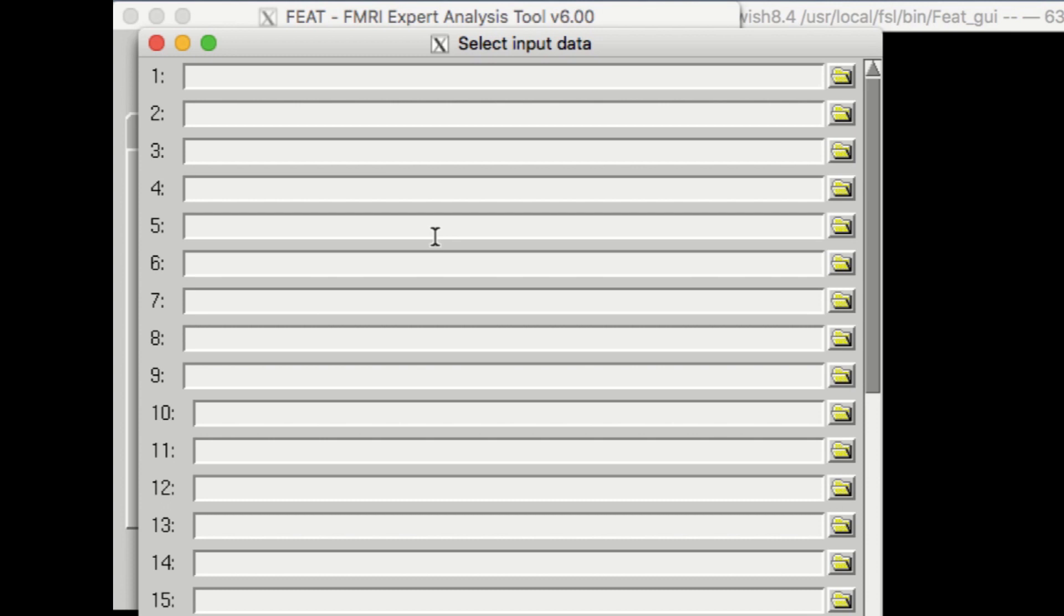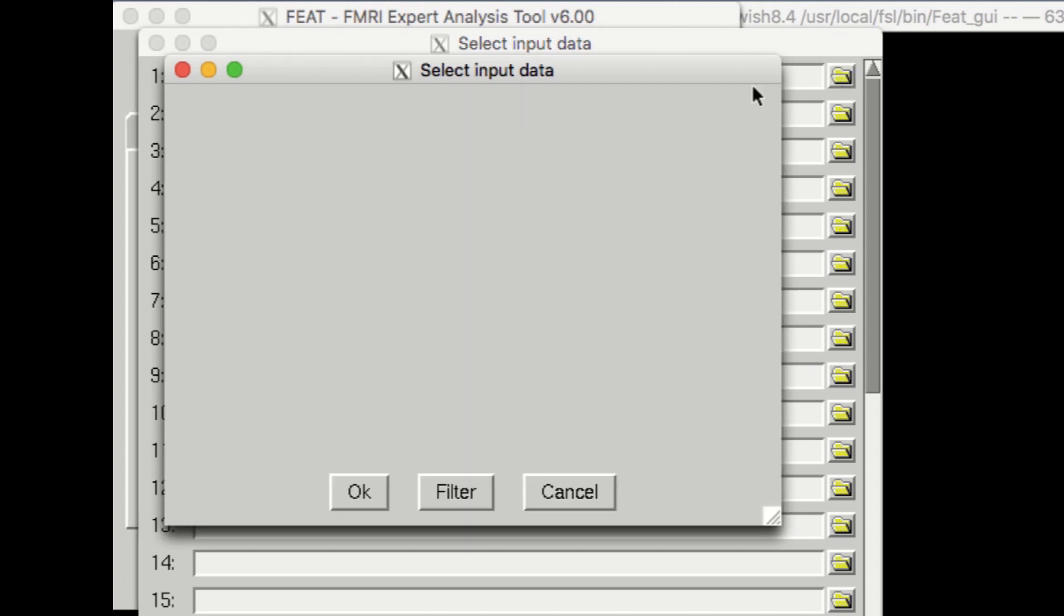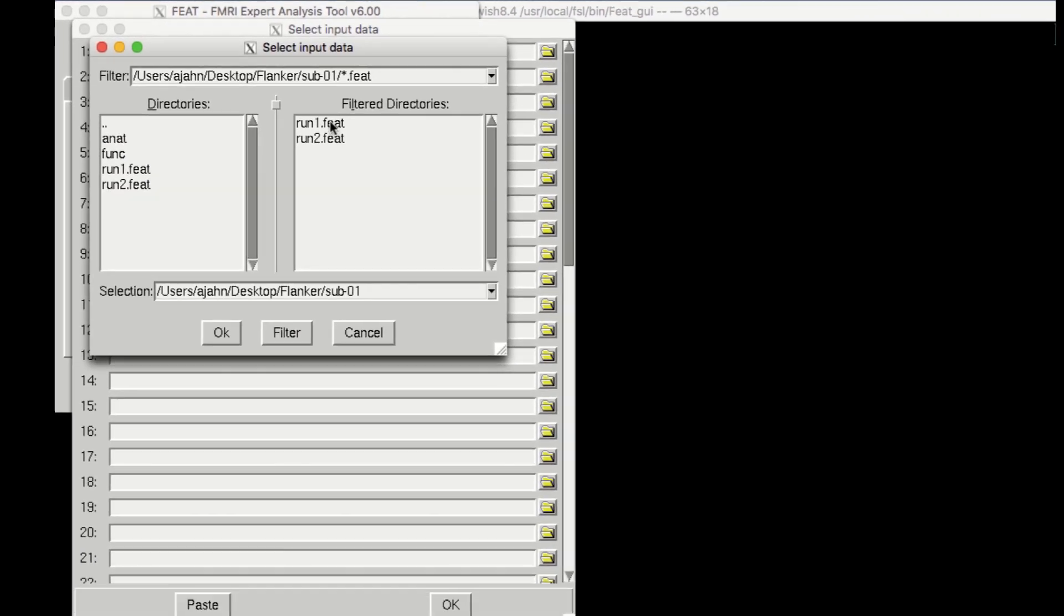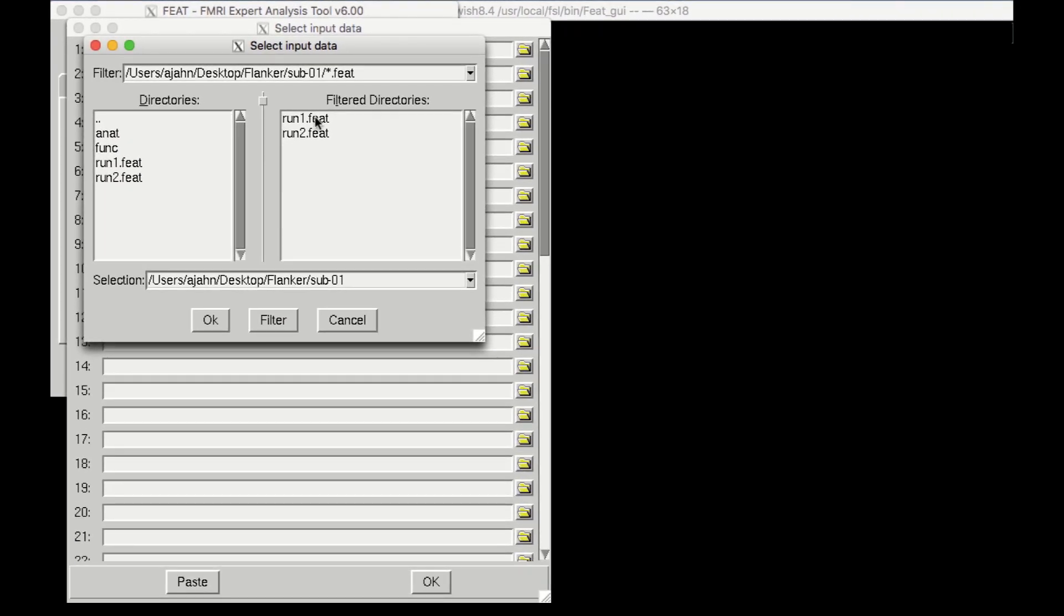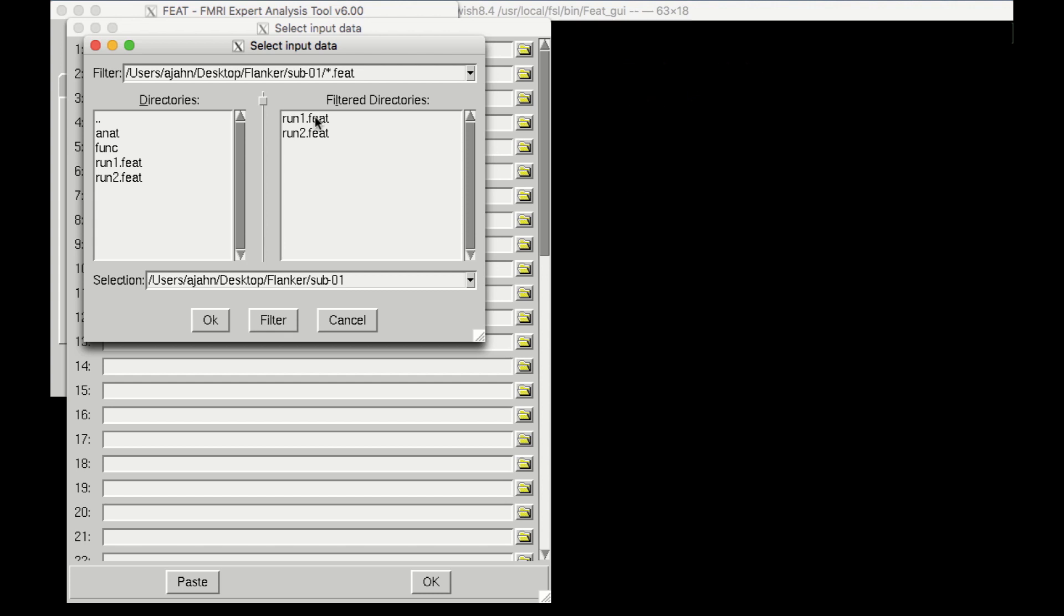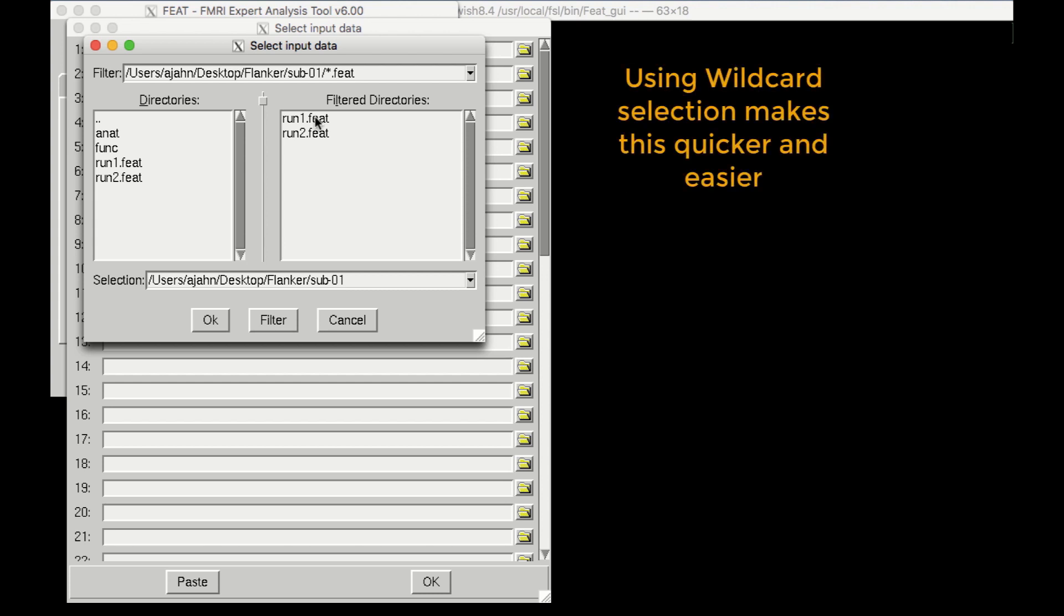You could select each of the Feat Directories by hand, clicking on the folder icon and selecting each one individually, but as we saw with scripting our analysis, this isn't practical for large data sets. Instead, we'll use wildcards to make this quicker and easier.